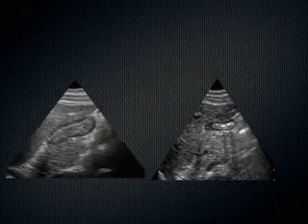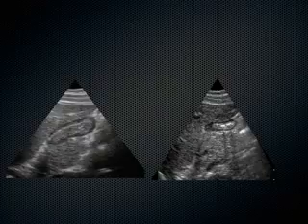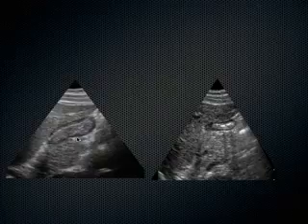Okay, now, for those of you looking at your iPads and can see the lecture and the answer, don't shout out just yet. Look at this image here and tell me what organ you think you're looking at. It looks like a gallbladder, right? It looks like a gallbladder filled with sludge or something, but it's not. Remember when I told you that this organ looks like this all the way from the esophagus down to the rectum? It's got this hypoechoic wall to it. So this is a loop of intestine.